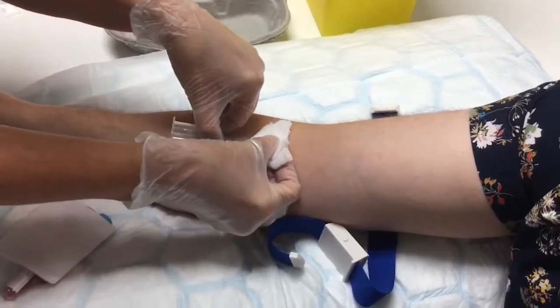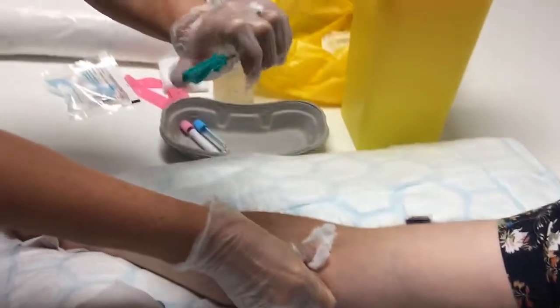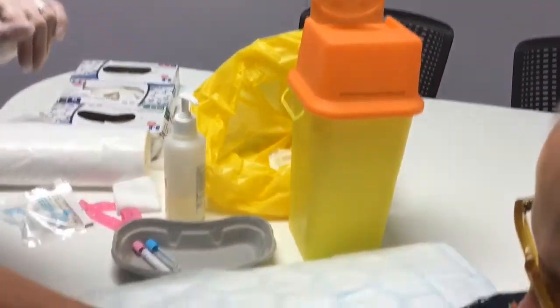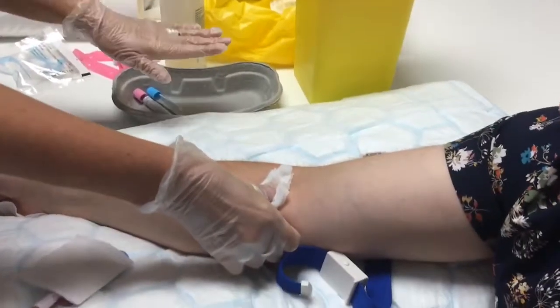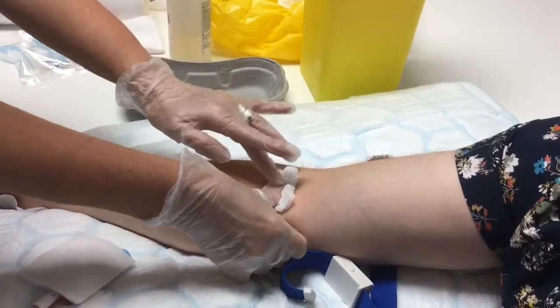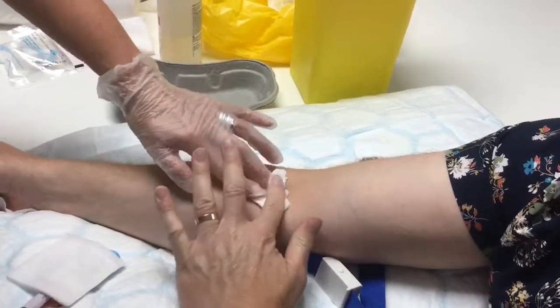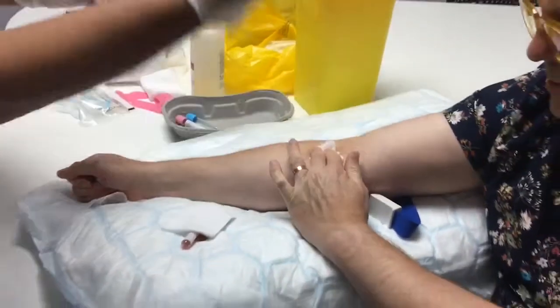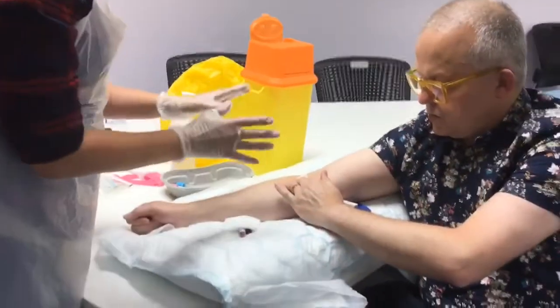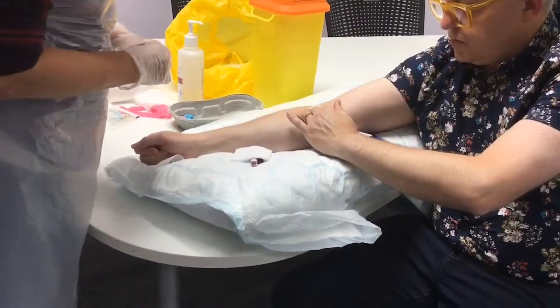Release the tourniquet. Get your piece of gauze or cotton wool — don't press on it because the needle's still in there, or you'll damage the arm. Hold it over, gently remove the needle, and firmly apply pressure. Then click and sheath the needle so it's safe, and put it straight to disposal — not back in your kidney dish, straight away for safety. Press on the wound. If your patient is able, they can press on it, but don't get them to fold the arm, as it makes the hole bigger. Then put a plaster on when they're ready.